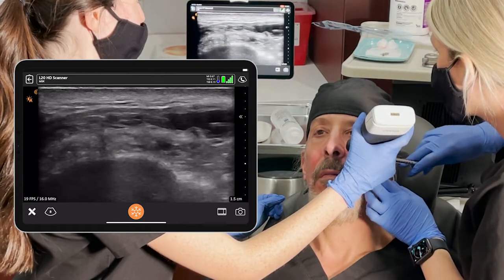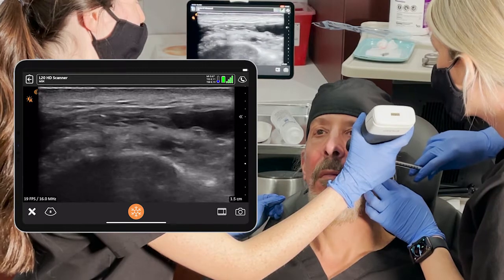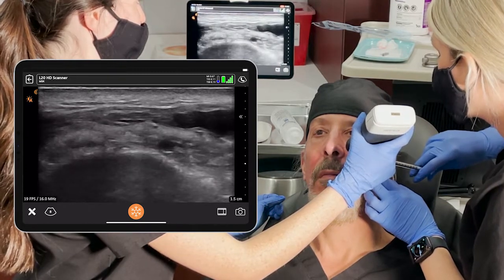That's kind of a blind procedure for me. Keep in mind that this was basically painless — there was a little bit of lidocaine added.